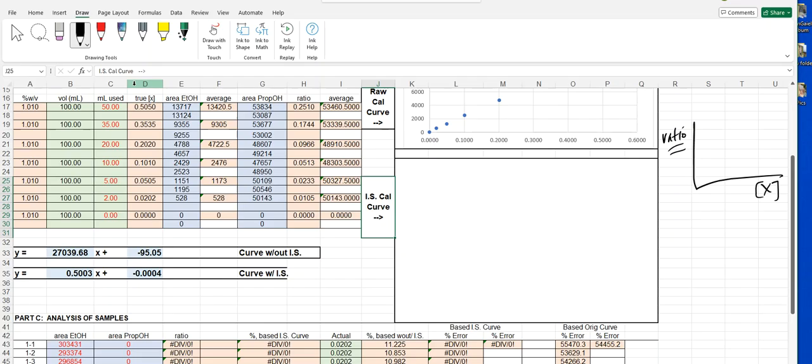That internal standard was present in every single thing that we injected. It showed up, and it had an area provided to it. We took the area of the ethanol, divided by the area of the internal standard. We got a ratio number, and that corrected for the auto-injector. If it injected too much one time, then we're compensating for that. If it didn't inject that much at all, or it was shortchanging me a little bit, we compensated for that one. All of those went through, and all of those were corrected and scaled accordingly based on the ratio number that we have to do with internal standards.